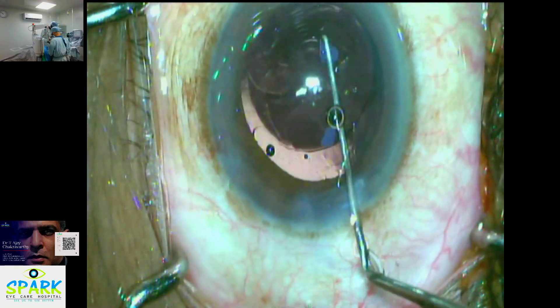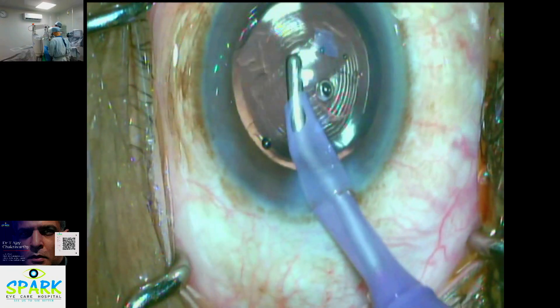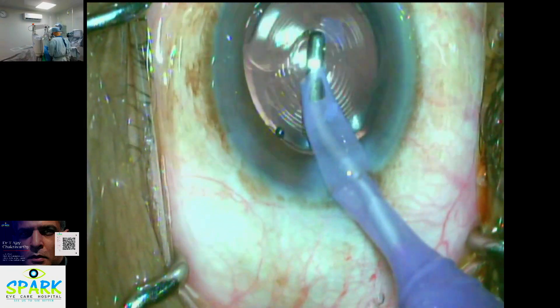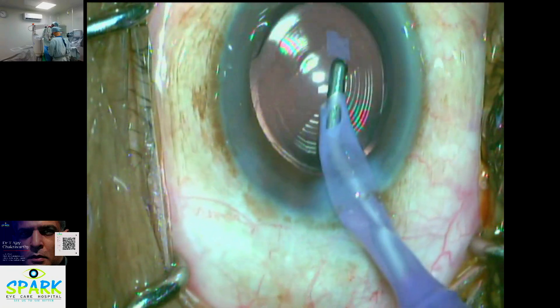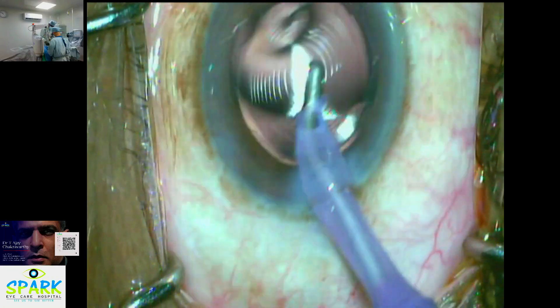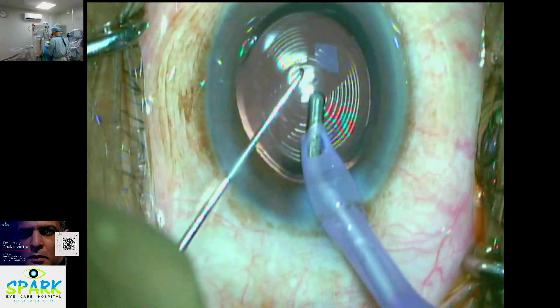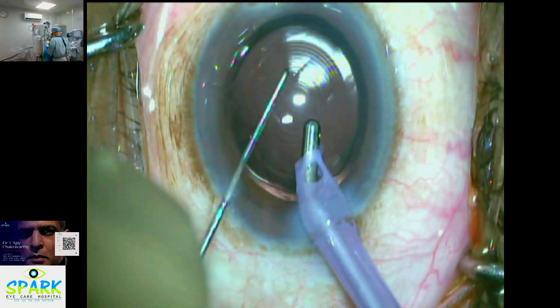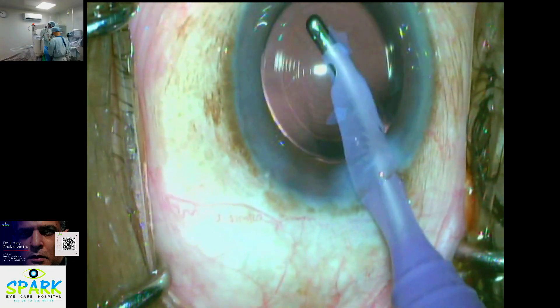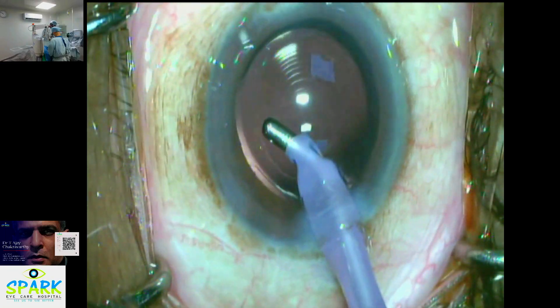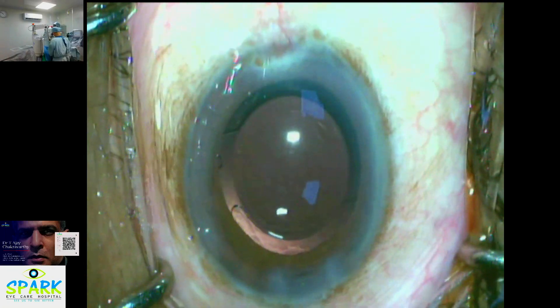When you look at the lens, you can see the lens positioned on the correct side. This lens is a multifocal lens. This is the hydrophilic multifocal lens.